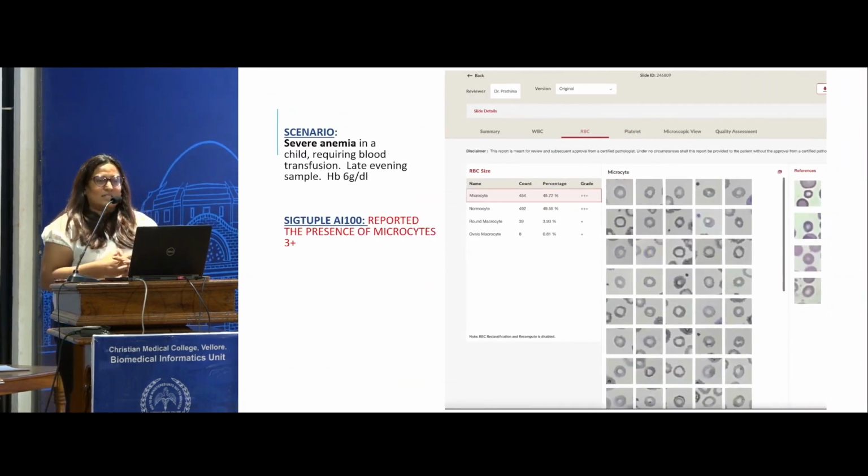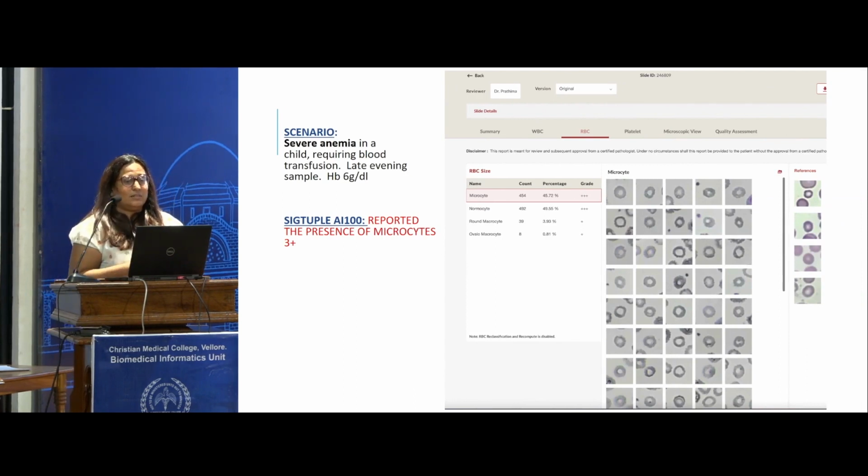And this is one of the clinical scenarios I was talking about. There was a patient in a remote place, where we have Ashwini Hospital, in Gudlur. It is a remote hospital where connectivity is very poor, but we have placed our device there. The pathologist there is usually not as trained in reporting peripheral smears as we are in Bangalore or other tier 1 cities. So she scans the slides there, and our pathologists in Bangalore can look at the images and report from Bangalore.